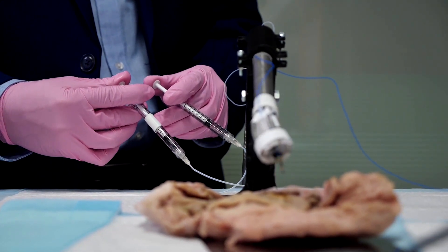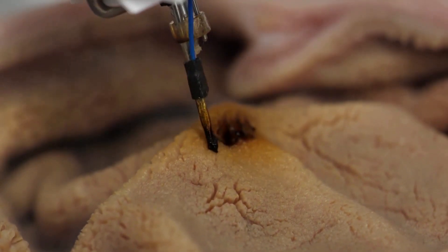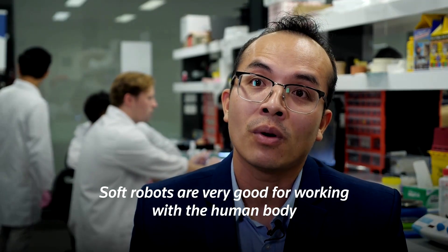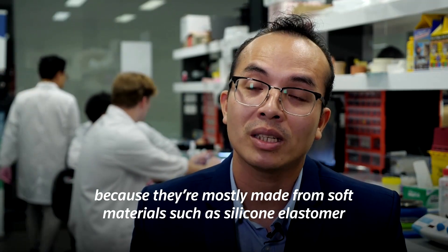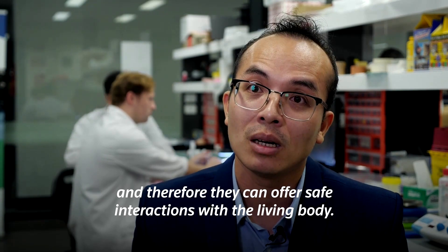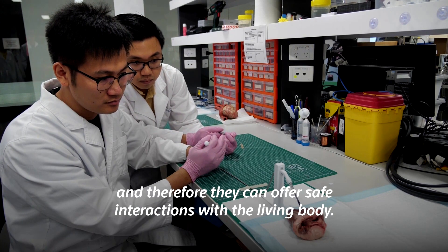The printing nozzle can print pre-programmed shapes or can be operated manually if more complex or undetermined printing is required. Soft robots are very good for working with the human body because they are mostly made from soft materials such as silicone elastomer, and therefore they can offer safe interactions with the living body.